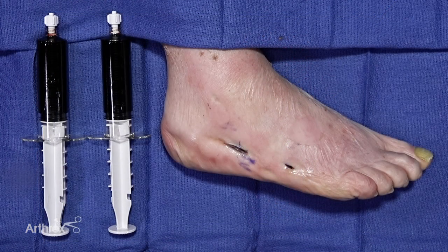At this point we've already harvested a bone marrow aspirate — whether it's from the iliac crest, proximal tibia, distal tibia, or calcaneus, you can utilize any one of these sites for that. We will then utilize the Angel system for a further spin down of this.